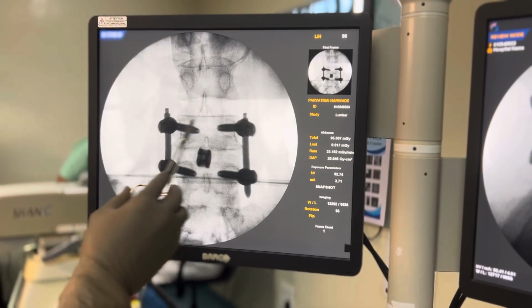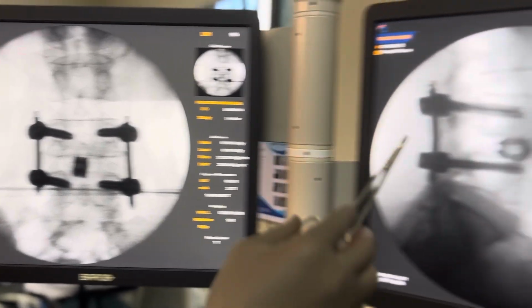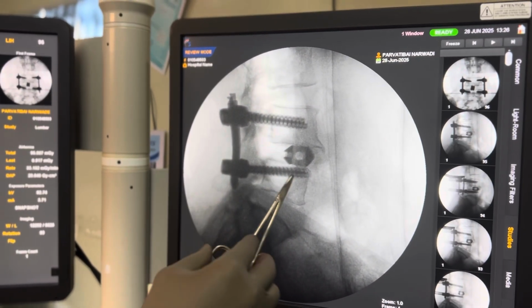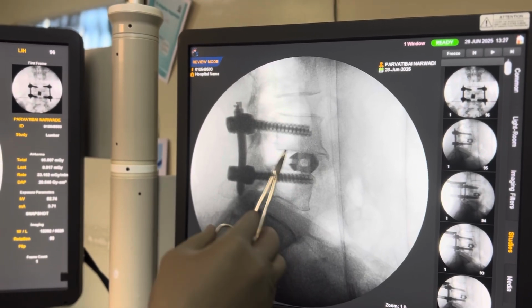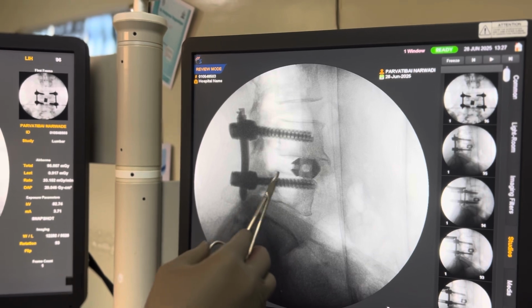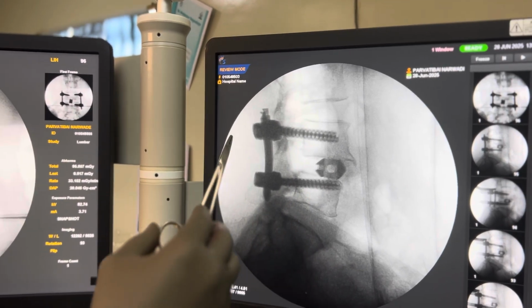Final fixation: 4 pedicle screws, cage in the center, that's on the lateral image, well placed pedicle screws, interbody cage of 13 mm, and the listhesis was already reduced on the position only. So that's the final fixation.